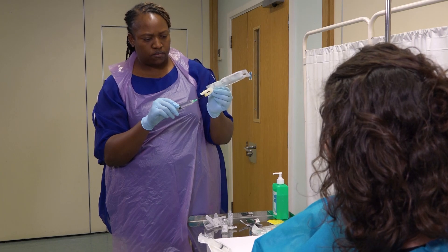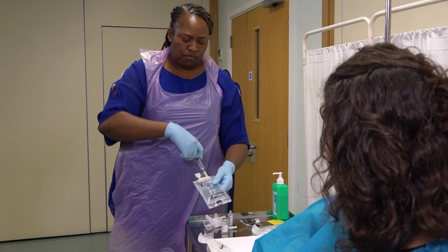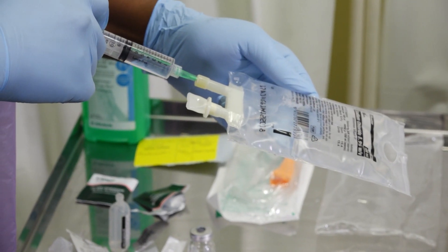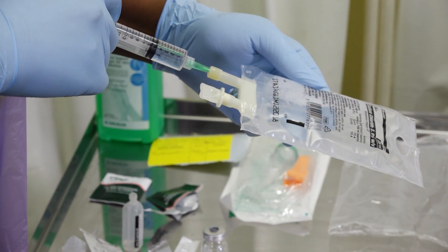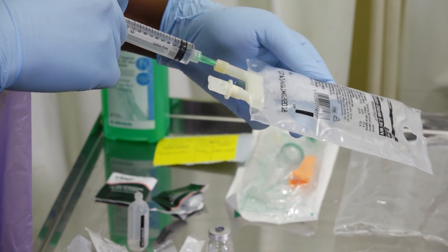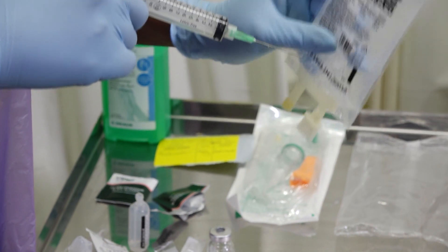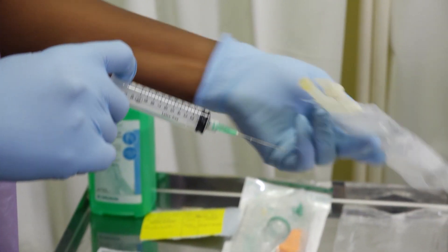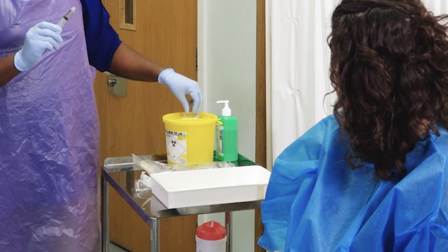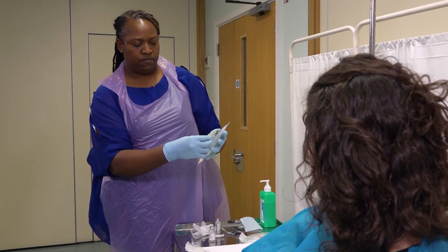Press the drug additive port on the fluid bag with the syringe and inject the drug. Agitate the bag to mix the drug and attach the drug additive label.